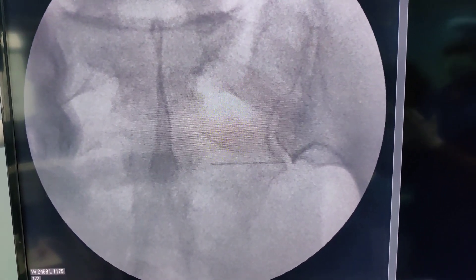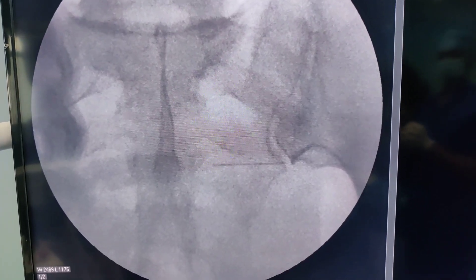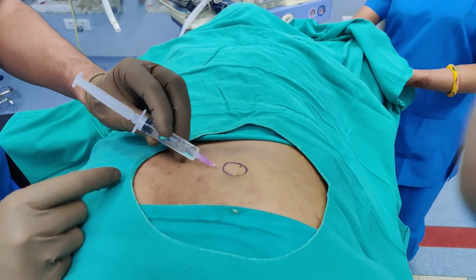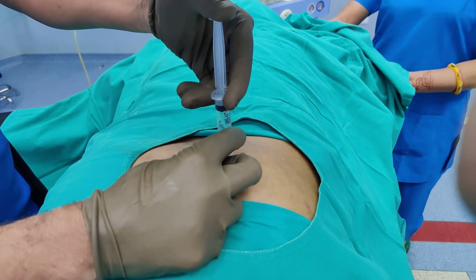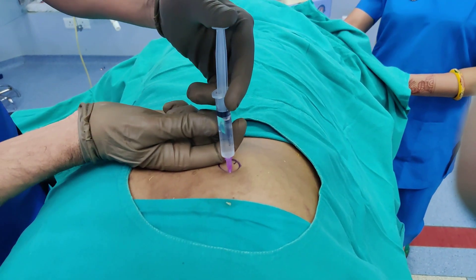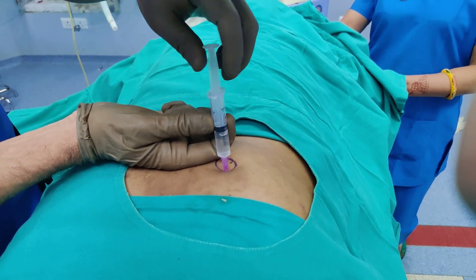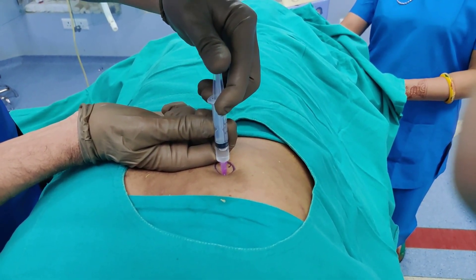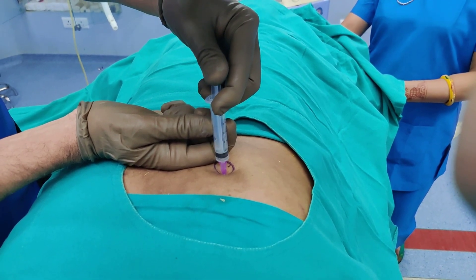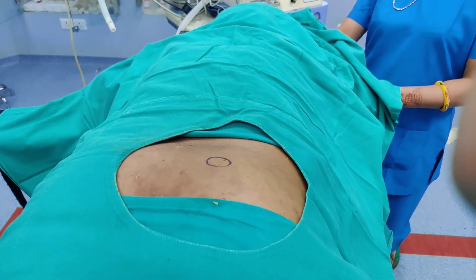My next step is to take the needle vertically and inject along this track so I can insert the spinal needle without much discomfort to the patient. Just go vertical, keep aspirating, and inject the local anesthetic to make that track pain-free. Then wait a few minutes for it to act.